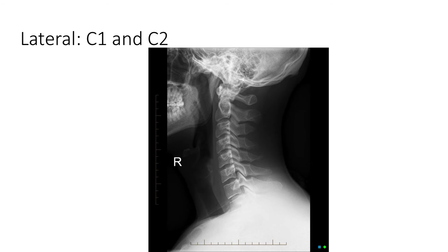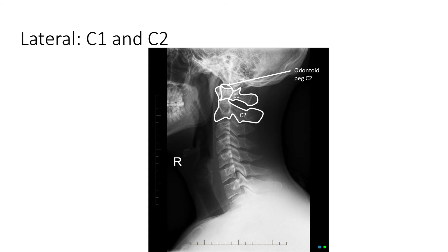We will now look at C1 and C2. The distance between the posterior aspect of the arch of C1 and the anterior aspect of the odontoid peg should be no more than three millimeters in adults. The ring at the base of C2 should remain unbroken anteriorly, posteriorly, and superiorly.